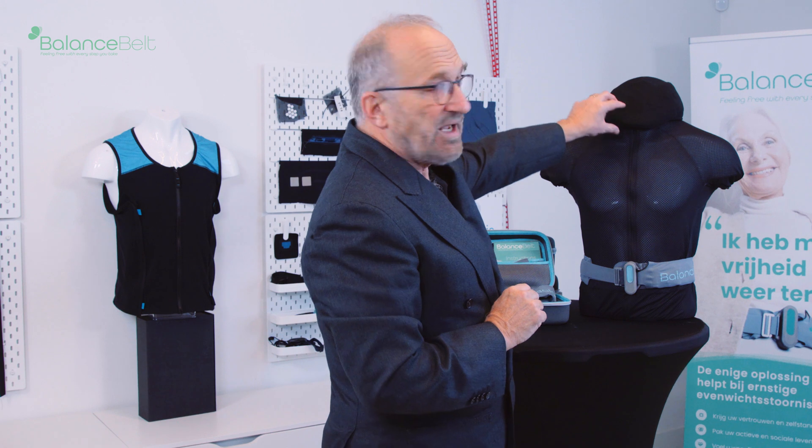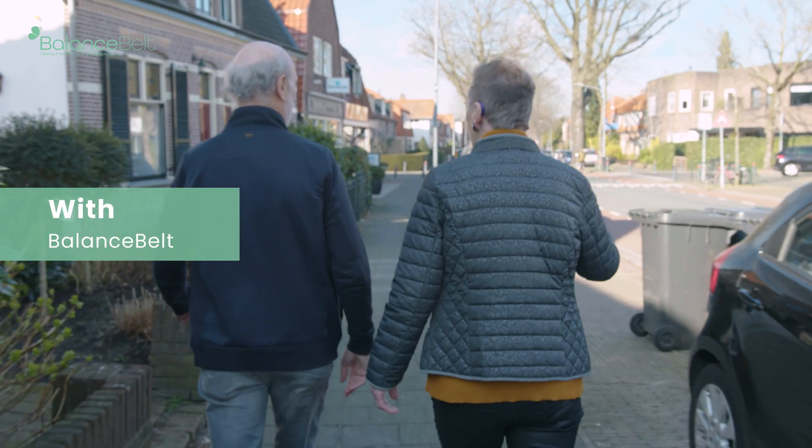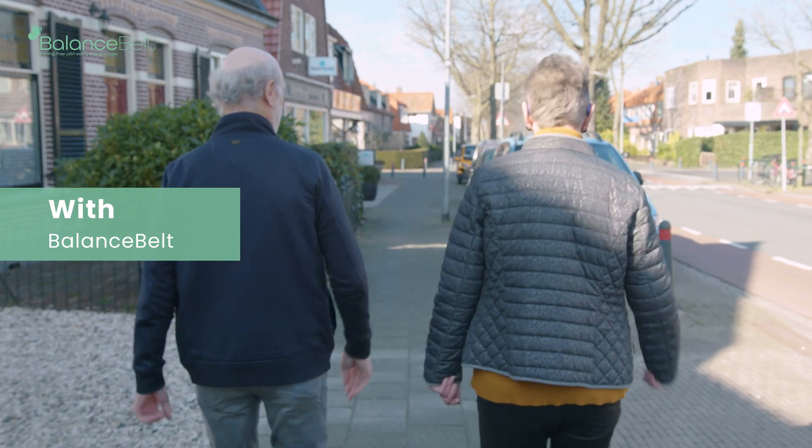After wearing the belt, you also evaluate again whether they can stand in tandem with eyes closed and ask them to walk 10 meters, turn around with and without moving the head from one side to the other, and you observe the quality and balance of gait. Last but not least, you ask them while they are walking to suddenly stop and pick up something from the floor, and to take an object from a high-placed shelf and put it back again. Generally we will see that the performance in picking up things, walking, and picking up things from the shelf will be improved.